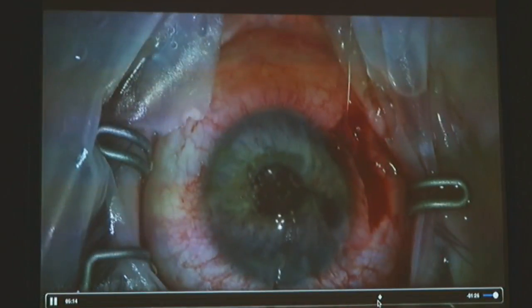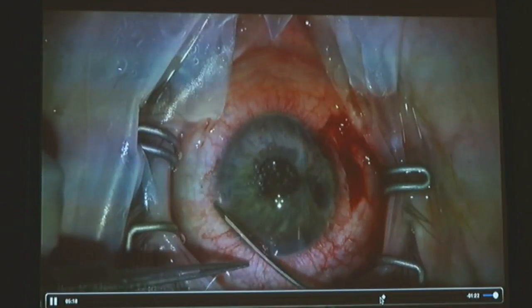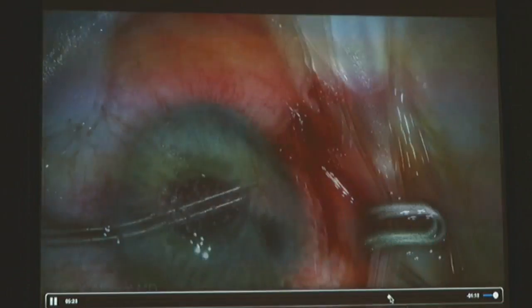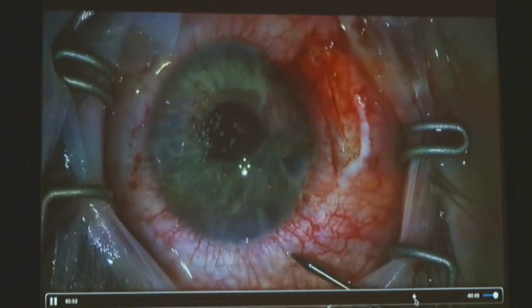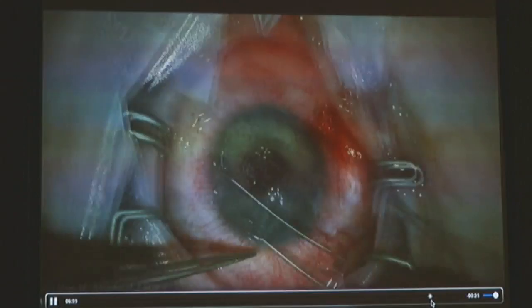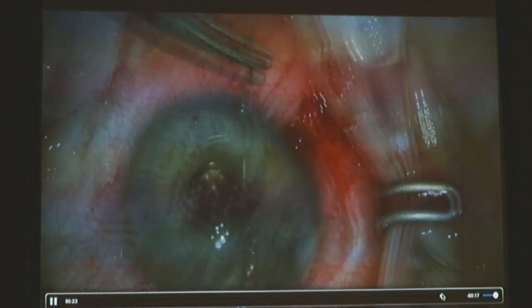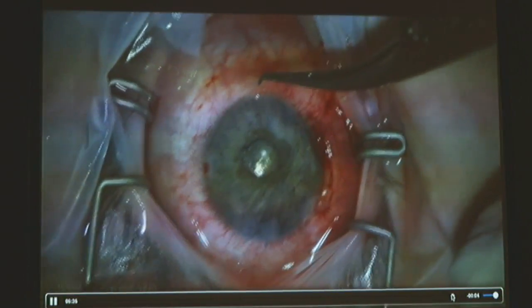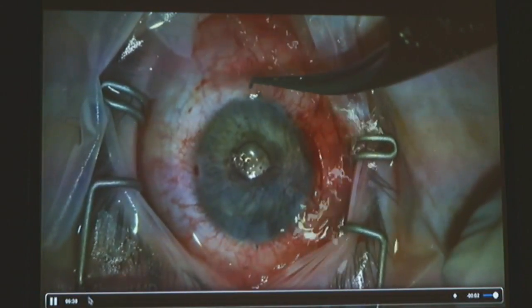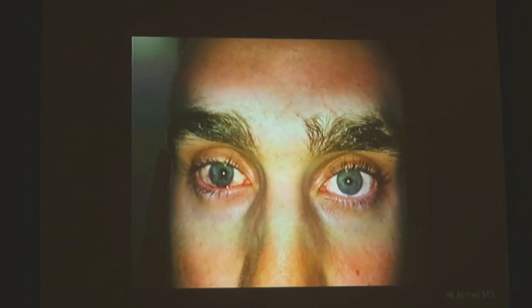So this is like putting a puzzle together, right? This is really a lot of fun, actually, because you really have to kind of improvise here, and it's like putting together an art piece. And what we do is like art. So multiple sutures there, multiple suture passes. You see I put 4 sutures here together, 1 here, and now we see the pupil come together, and we've taken him from what he looked like before, remember what he was before, to now. So this is about art.